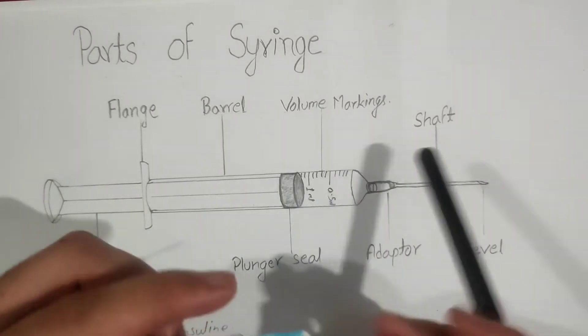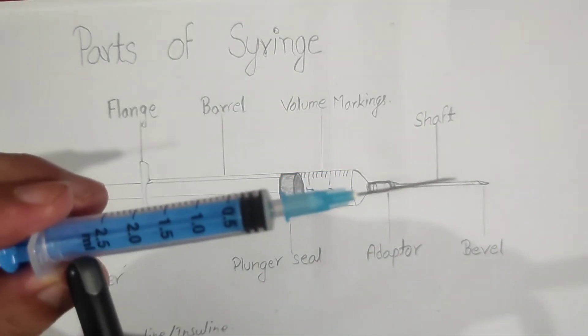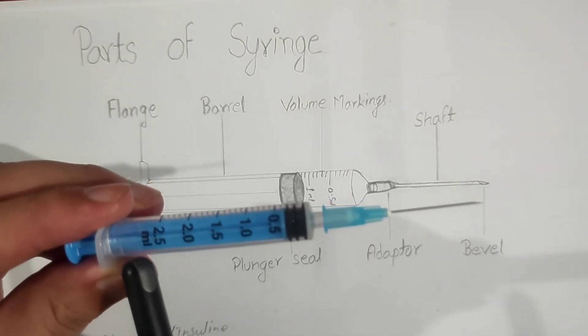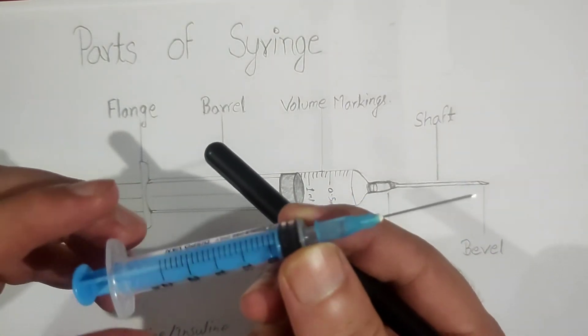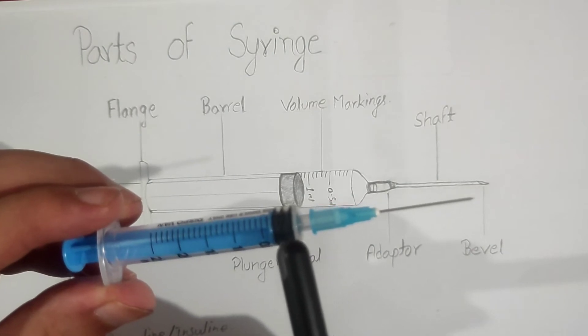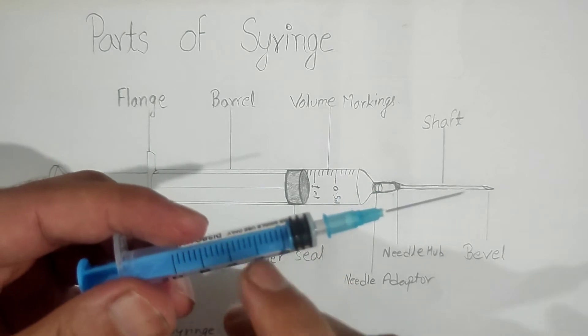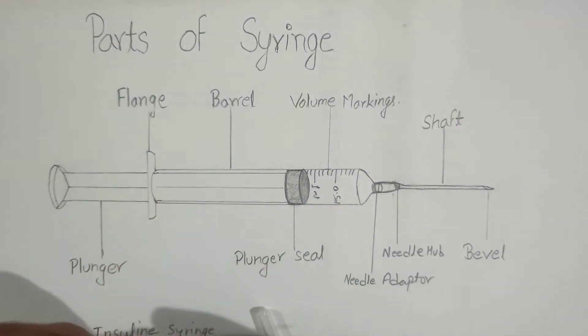drug are known as the volume markings. You can see here this is a 2.5ml syringe, so it is marked up to 2.5ml with gaps of 0.1ml. This indicates the volume of medicine in the syringe.